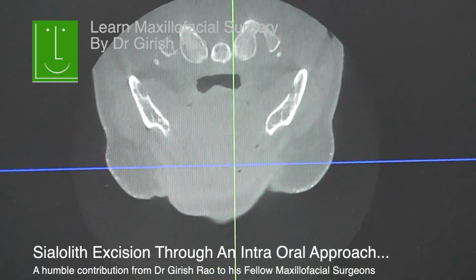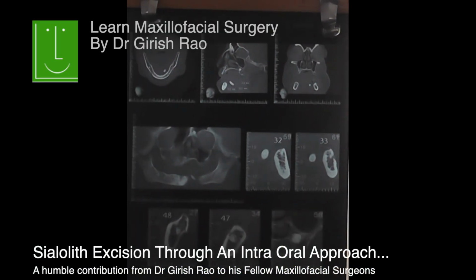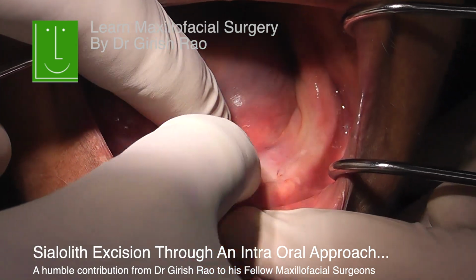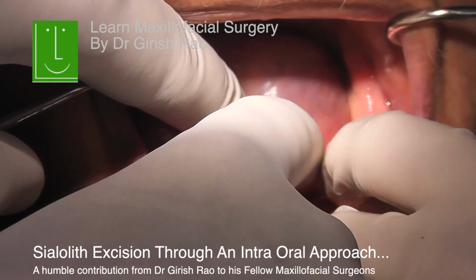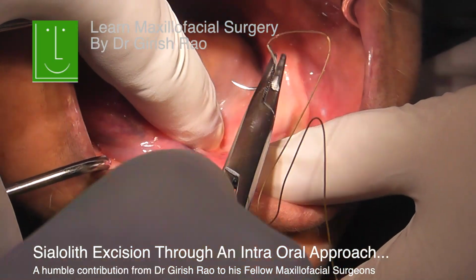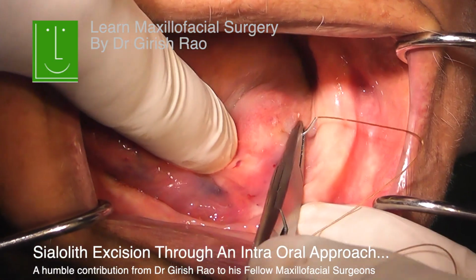That's the axial section which you can see there, and you can see the stone, a large stone, and this is the coronal section, and on the sagittal also you can see it here. Clinically you can palpate quite deep sometimes. Many times you can feel the stone very easily, but if the patient is obese, it could be a big problem in palpating.